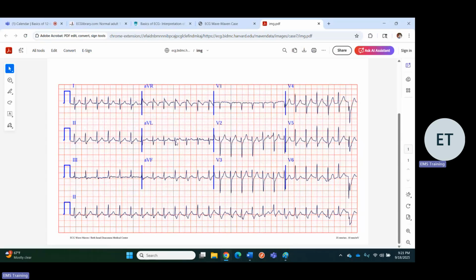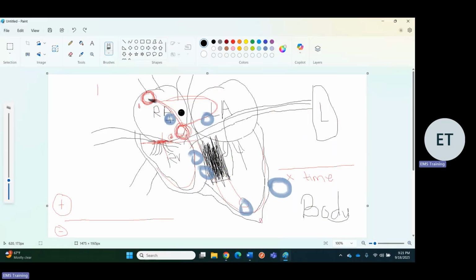Having a P wave looking thing. I mean, this literally looks like it's 4 beats in a row. What are the odds that the artifact occurs in the same spot 4 beats in a row? The amplitude of the R wave here is 50-50, and then it's a lot smaller here. What shortens the R wave? What shortens the R wave is coming up this way, because remember your lead if you're in like V1, and everything goes towards it.